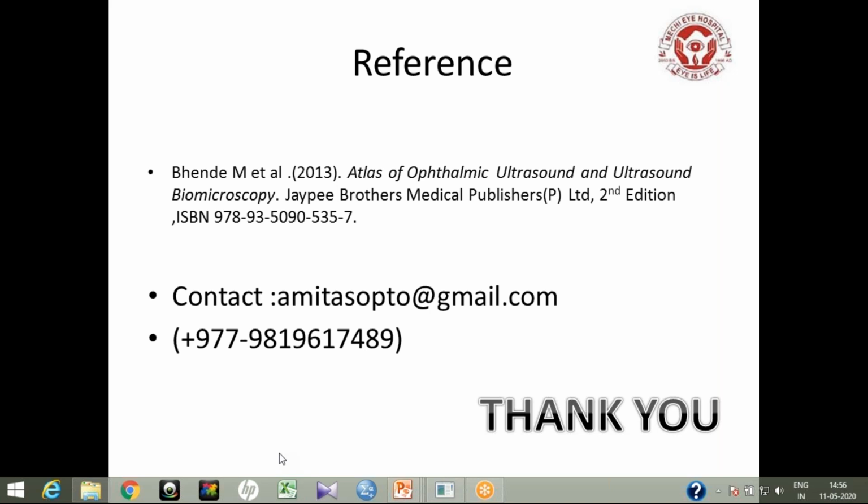Suppose we are doing a paraocular scan in case of an orbital scan, then we have to place the probe at the lid, because to see the lid pathology we have to place the probe at the site of the area of interest. Suppose a lid abscess is present in the upper lid, then we have to place the probe at the upper lid, not the inferior lid.